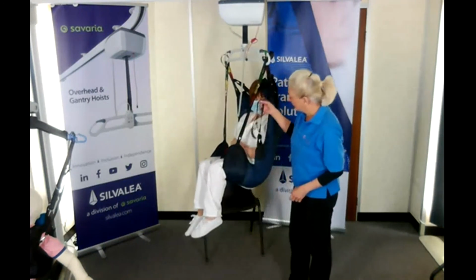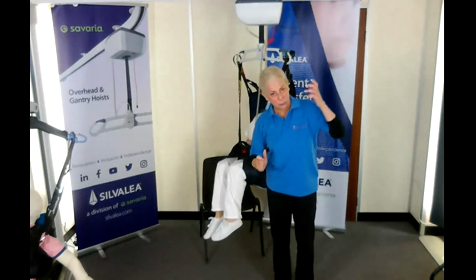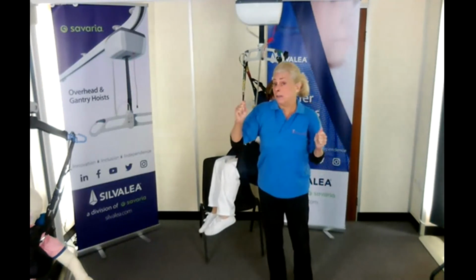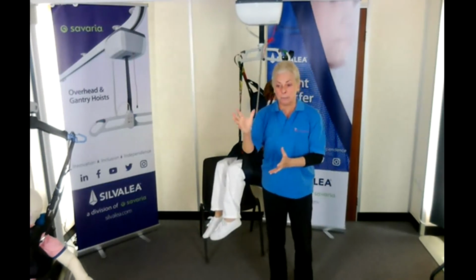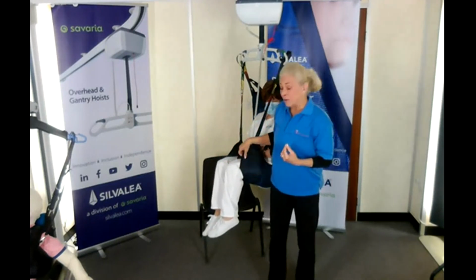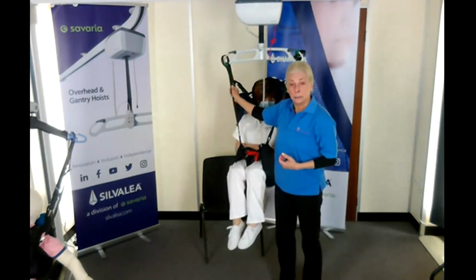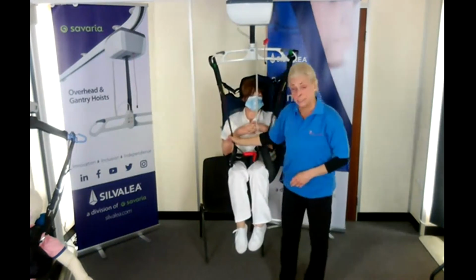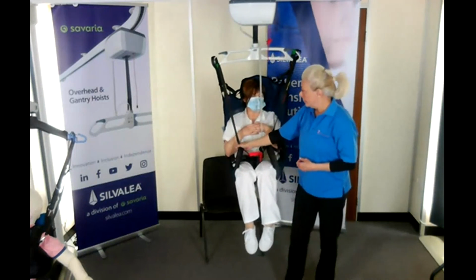So just adjust. But quite good for if you've got asymmetrical shapes, and you can adjust the tapes asymmetrically so that you can try and get a better position for that transfer. If you've got someone trying to hold somebody in, you just need to adjust. Slings are very versatile, and that can be achieved quite easily, even if you've got to hook up one side slightly shorter. So you would do that with your risk assessment. But certainly these slings, they get very useful.